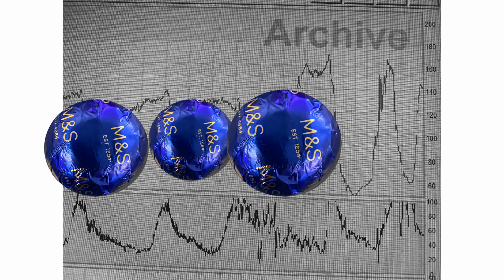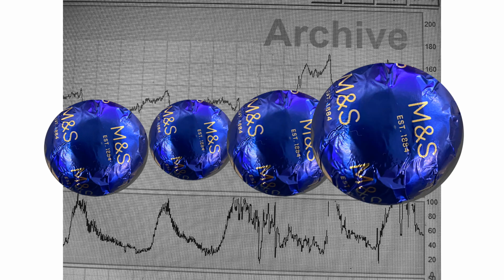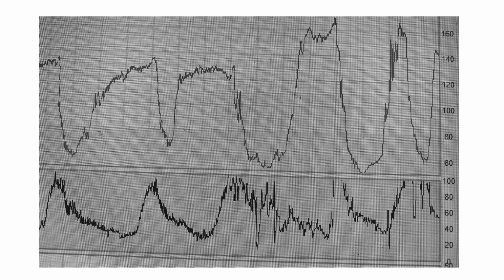So if you cover those atypical variable decelerations, which are baroreceptor mediated decelerations, and look in between the decelerations, we could see that the fetus has increased the baseline fetal heart rate due to catecholamine release, but the variability is still normal. If one uses a pattern recognition guideline, this would be classified as a pathological CTG trace. However, it means nothing to the fetus.